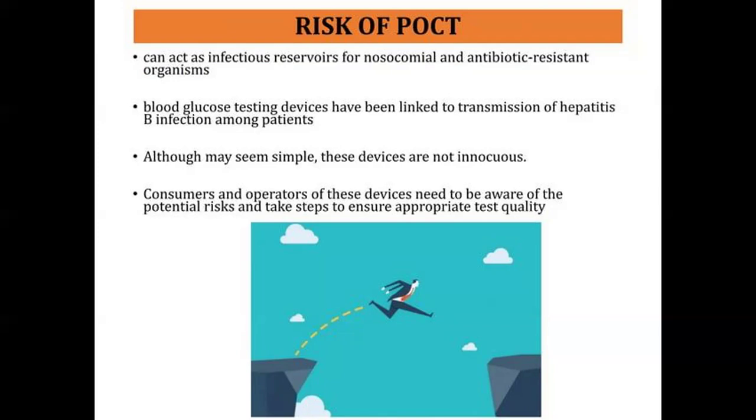Sometimes there will be a false negative, and people should not panic about it and should not go for self-defined medication when they come across certain parameters in their blood or urine. Even with a blood glucose sensor, if suddenly you see the glucose level shoot up and you doubt it, you can always approach a clinic for secondary confirmation before coming to some conclusion and taking self-medication. So that is a risk of POCT.